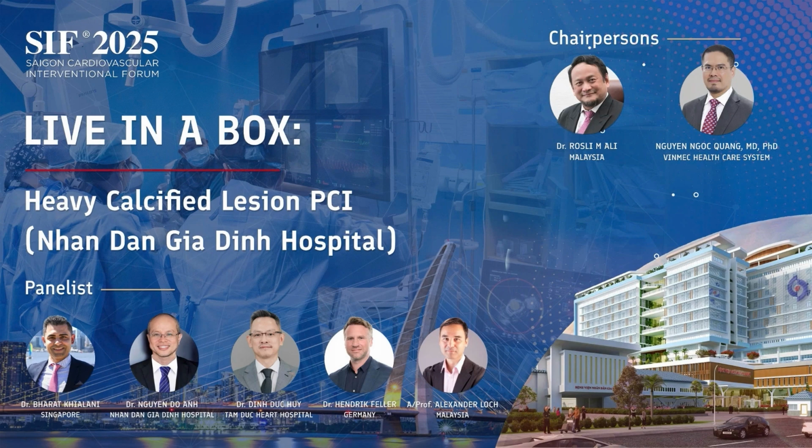So how about Dr. Takashi? I think the same. Yeah, I'd use a bigger balloon, but maybe try a scoring cutting balloon, a bigger one, then see how it works. Yeah. So in this situation, do you protect the circumflex? Because I didn't see the wire. Just for protection, the guide wire protection. I think that's enough. Yeah.